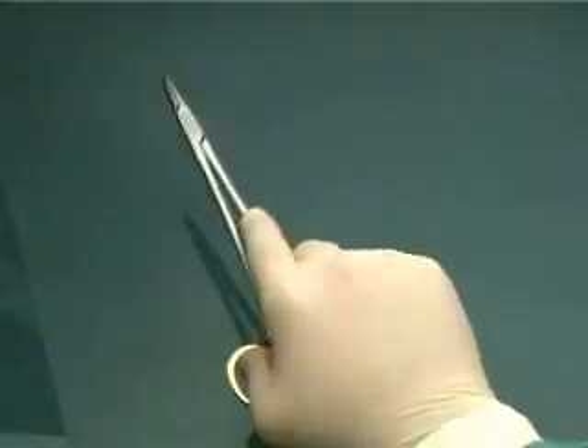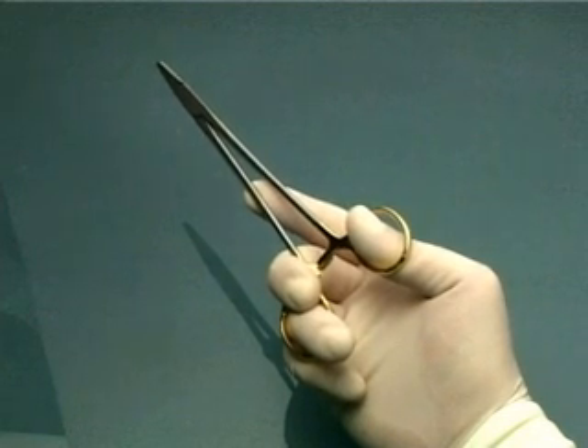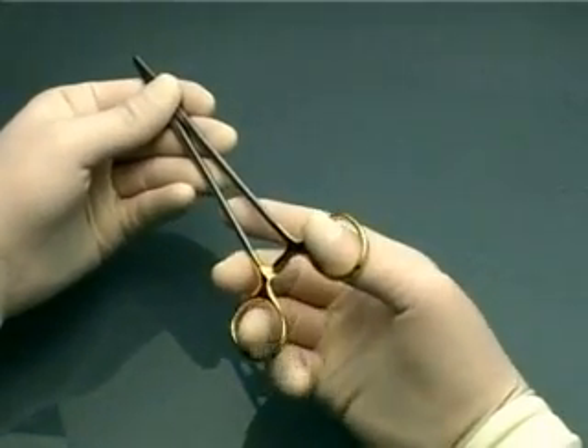If you are new to suturing, you may find this the easiest to start with. The other way is to hold it in this fashion, without your fingers in the rings — the palm grip.